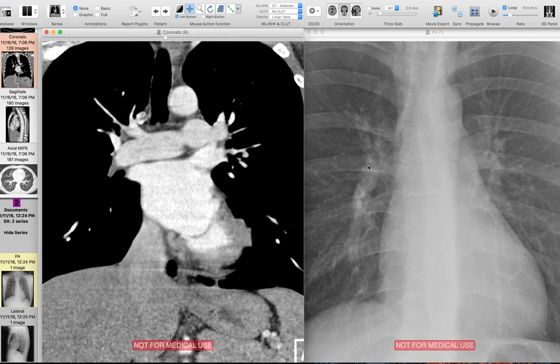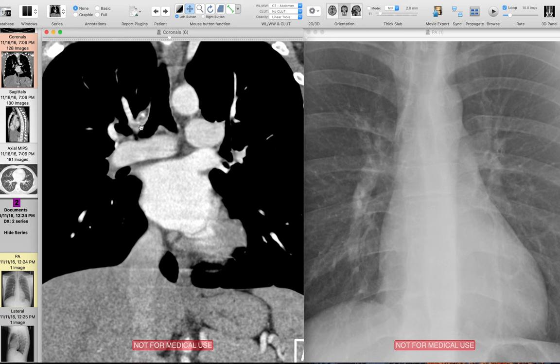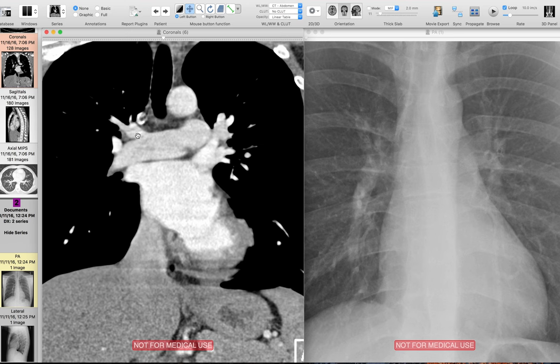Looking medially in the hilum, there's a border here that is the truncus anterior — part of the pulmonary artery that supplies the right upper lobe. On the corresponding CT, the truncus anterior supplies the apical and anterior segments of the right upper lobe, with a separate branch going to the posterior segment. So we have two vessels coursing superiorly in the right hilum: the truncus anterior medially and the right superior pulmonary vein laterally.